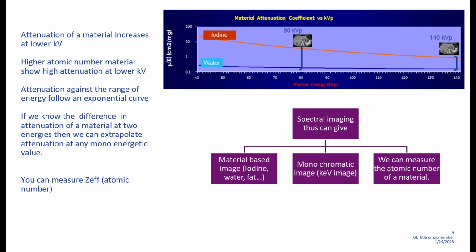For example, you are reviewing the abdomen. Soft tissue abdomen, you would look at 60, 70 keV. It will be very good. You want to see if there is a bony erosion, you please change your keV to 100 or 120 or even 140. So how is it different from the windowing that we already have in our older CTs? Window width and window level purely play on the Hounsfield values. It is not playing on the attenuation values. It's not playing on the energy or monochromatic attenuation values.